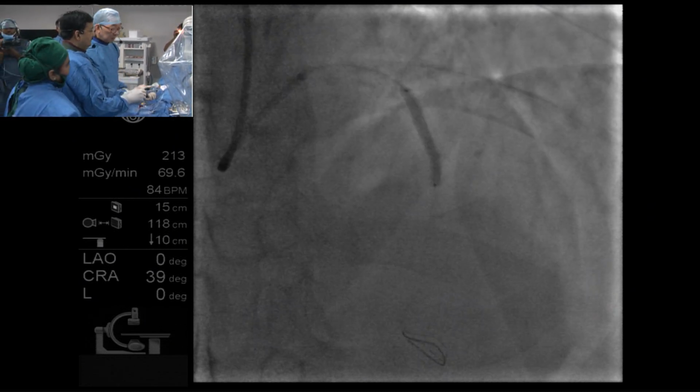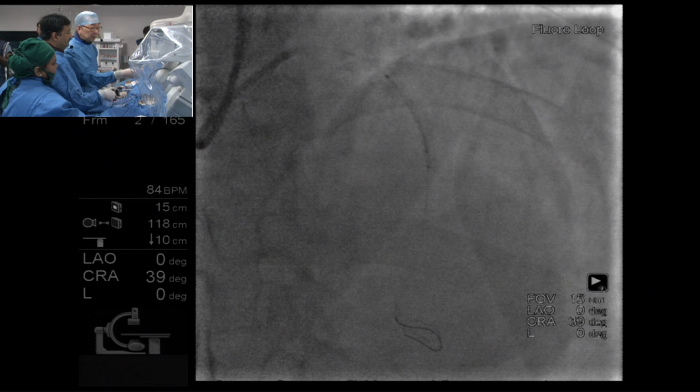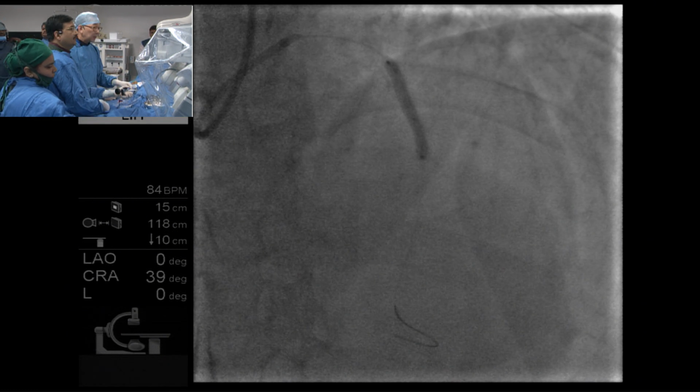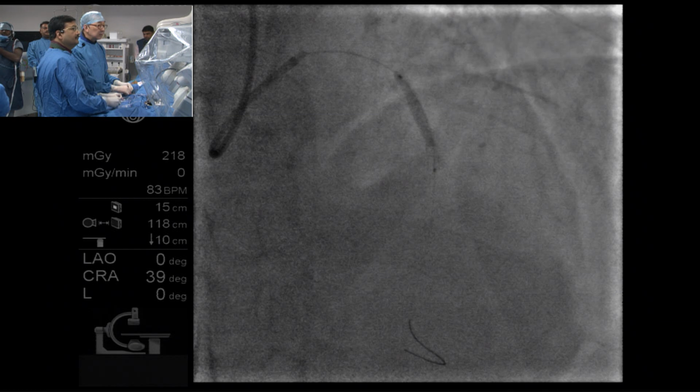Are there any comments from the panel? So what is this one? Before we go there, can you say 14? Okay, 14 down.